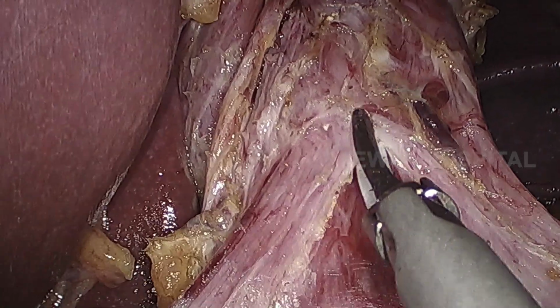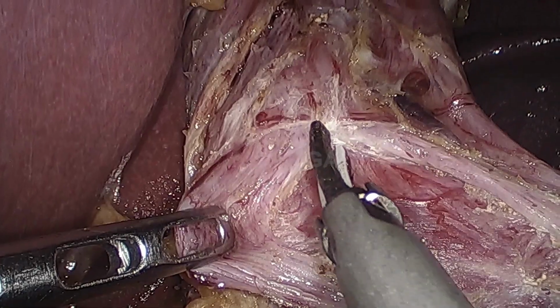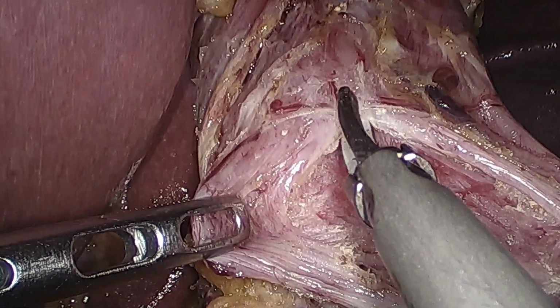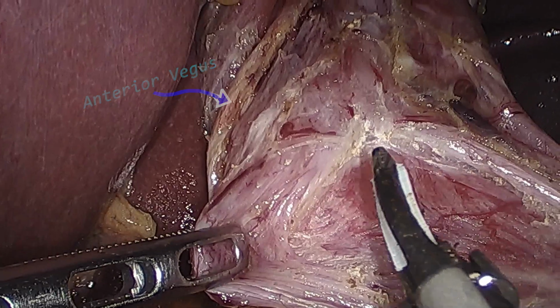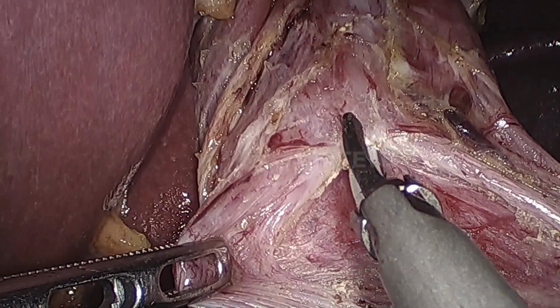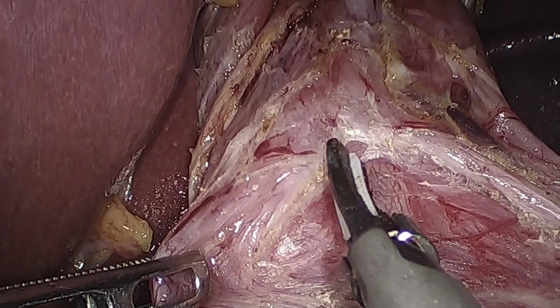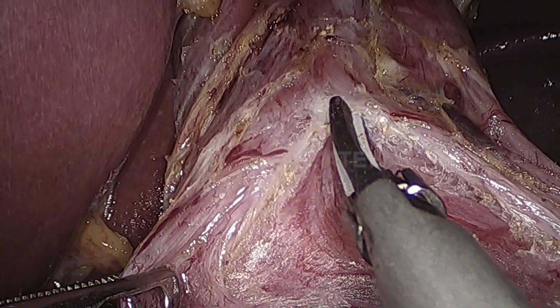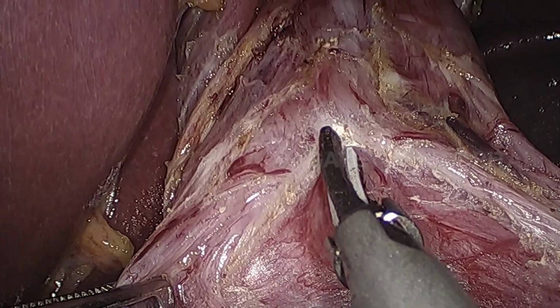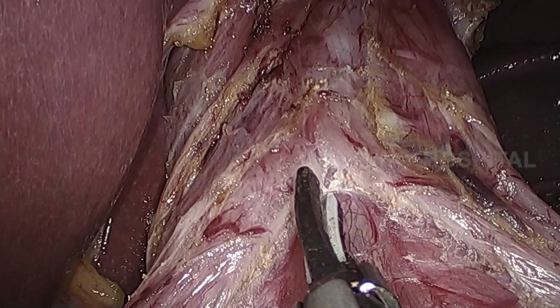Even if there is any perforation to the mucosa of the esophagus, there is no need to be worried. Only thing you should do is a fine suturing of the esophageal mucosa, and you can cover the esophageal suturing with anterior Dor gastric fundal wrap. That will actually help in preventing the leak post-operatively.